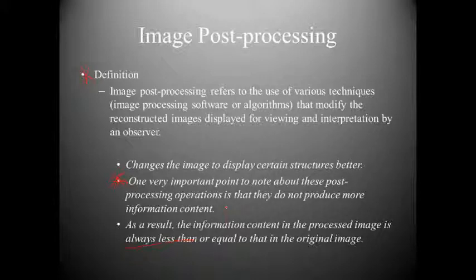For example, just a routine example, if the patient is moving their head and you're not able to control it, and in the middle of your scan, the patient tilts their head down, and so where the scan should have stopped, and it does, you actually clip the vertex of the skull. If you initially just completed the scan there and did not add images to acquire this portion of the skull, then you could not somehow find this portion of the skull without scanning it, because the information content would stop where you stop scanning.